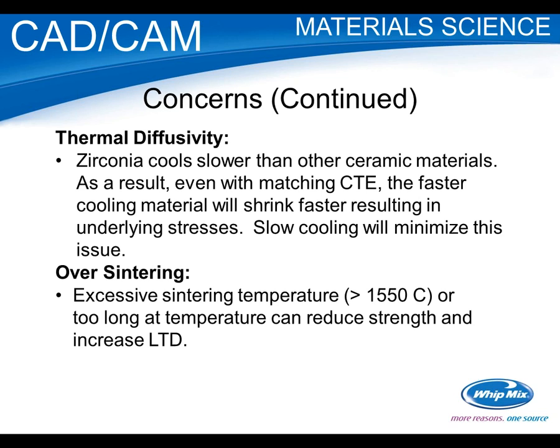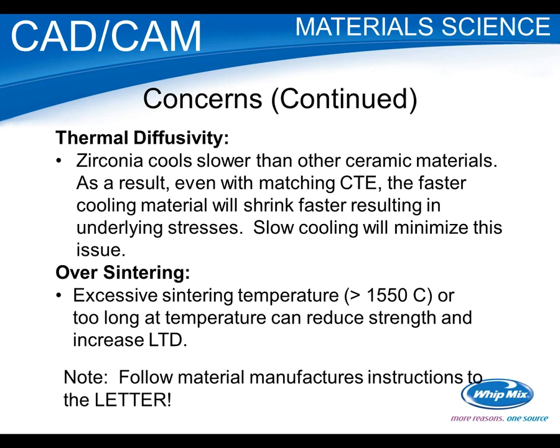The other problem is over-sintering, and I'm going to talk about this further, but sintering is one of the process steps that you're going to do. A lot of the other properties of zirconia were impacted by the manufacturer or set in place by the manufacturer. But you are actually going to be sintering. And so there are things you can do to the zirconia. Again, we're going to talk about that a little bit more in a bit.